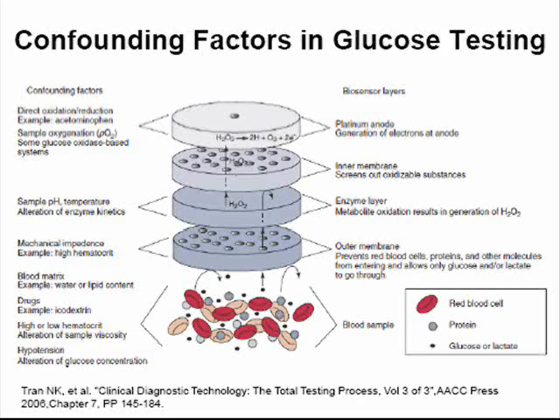Patients who are anemic, who have a low red blood cell count or low hematocrit, may have a higher plasma content, which leads to the device detecting a falsely high amount of glucose in the sample. Additionally, red blood cells in polycythemic patients could also mechanically impede your biosensor. Of course, there are many other issues that could come into play, and they are discussed in a variety of literature, including the one shown below.